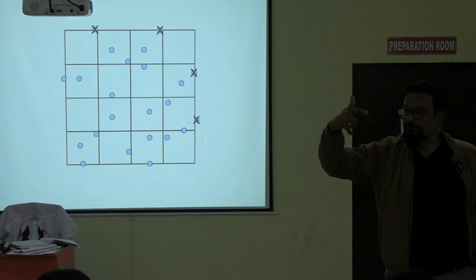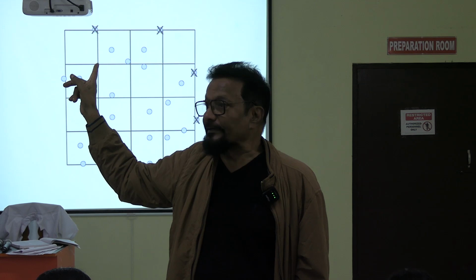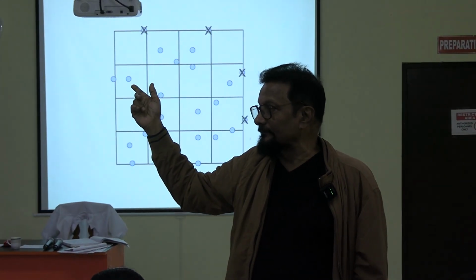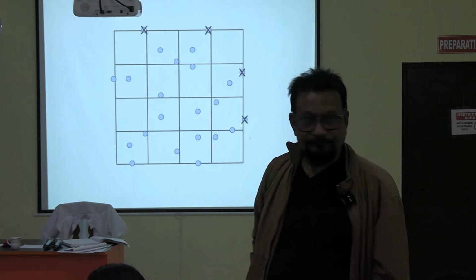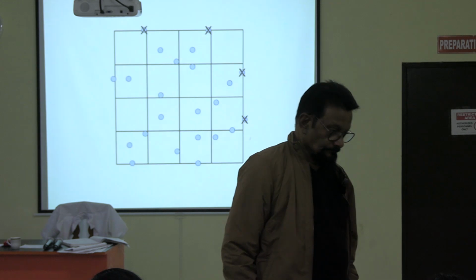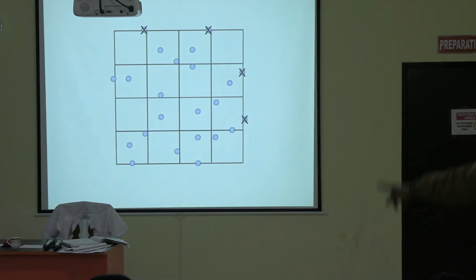Any doubt about the count number 19? It is 19, or more than 19, or less than 19? 19. So, okay, you are confident. Okay, now you calculate. Tell me the TLC. First, write the area. How much is the area?